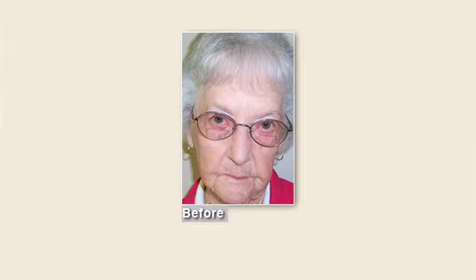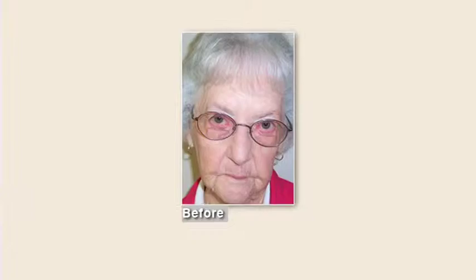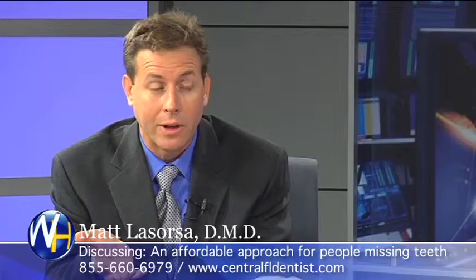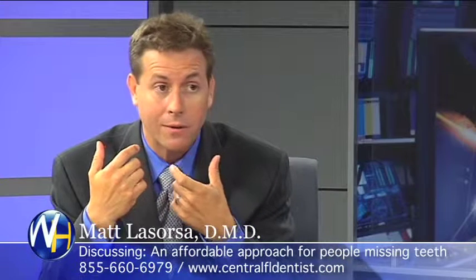What were her options? Like when you explain this to them, because you have traditional dental implants, you have mini implants. For her, traditional implants weren't even an option. She had such an atrophic mandible that the bone isn't wide enough to fit a traditional implant within the bone. The bone won't hold it. There's not enough room for it. So mini implants were her only option, other than doing nothing and suffering like she has for years and years. Even with a new denture, it's not going to change that much. It may change the aesthetics, but it's not going to change the function.